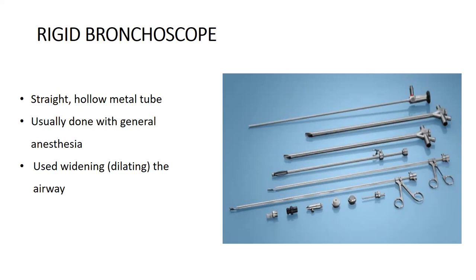So if you compare with a patient with hemoptysis, that is coughing blood, if you find a tumor in the airways, you can document where the tumor is, take a biopsy, and prove the diagnosis. The majority of life-threatening bleeding in the lung comes from disease in the lung parenchyma, maybe an active infection like TB, aspergilloma, or necrotizing pneumonia. All of these lesions which cause life-threatening bleeding are beyond visualization. Based on your CT, you know that the disease is in the right upper lobe or left lower lobe, and you do a bronchoscopy mainly to confirm before you go into endobronchial interventions, bronchial artery embolization, or surgery. You want to make sure it's that segment and that lobe which is bleeding.